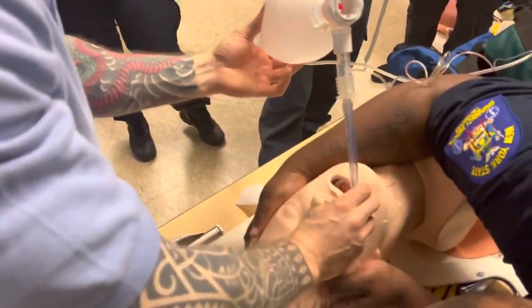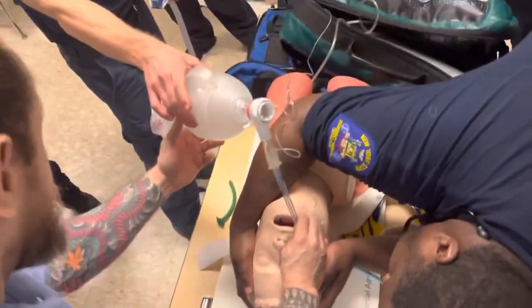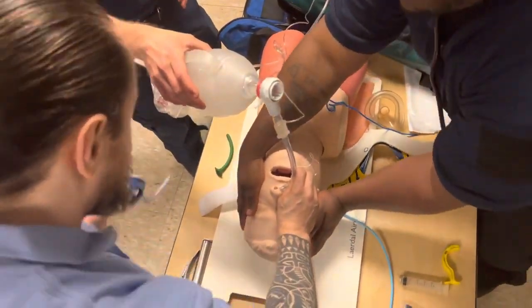But once we have established this, right? So you go ahead and ventilate it, right? And I'm going to take this from you. This is the bite block. James, you're still holding. And I'm not letting go.